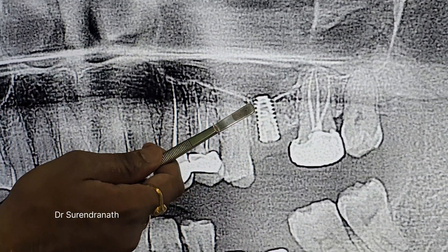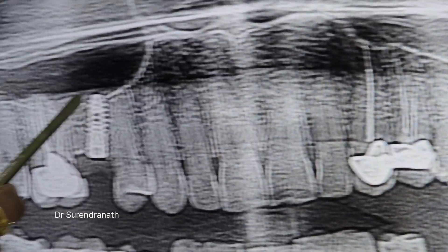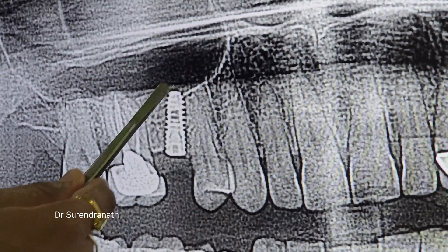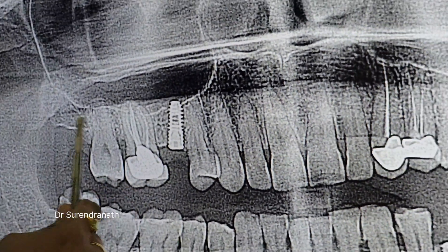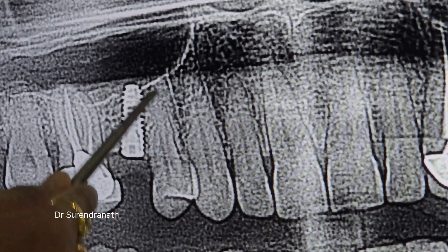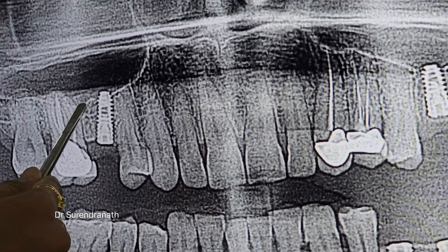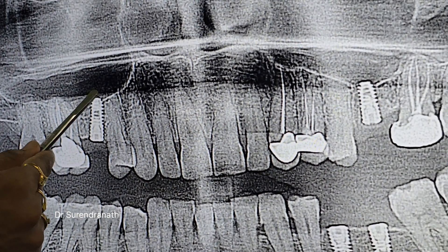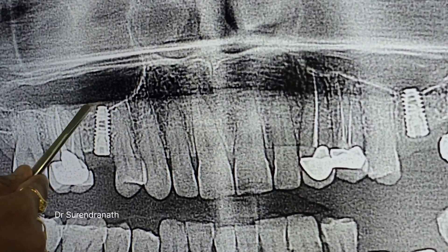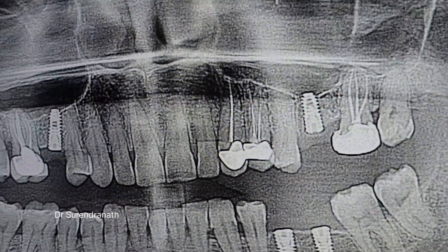This is the sinus lift, and this is also the second sinus lift. You can see — because of the two-dimensional image it may appear closer to the root but it is not close to the root. So this is again 2 to 3 mm of sinus lift here, and we lifted this with osteotomes.